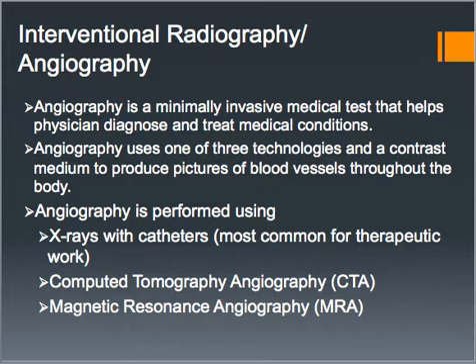Remember we talked about how MRA does not need to use radiation or the strong contrast that we use. But it's not going to always work for the same things. So, like I said, angiography can either use X-ray, CTA, or MRA along with a contrast material to help produce images of the major blood vessels throughout our body. So being minimally invasive is great. It gives doctors a second option without having to go in and perform surgery.